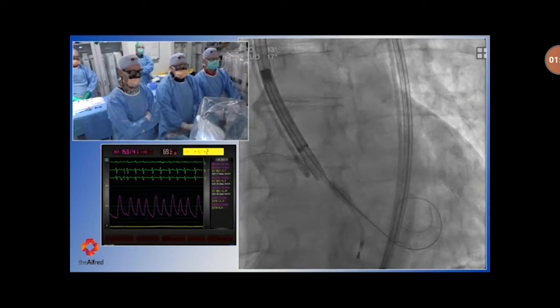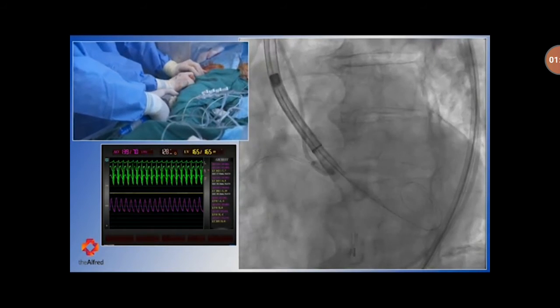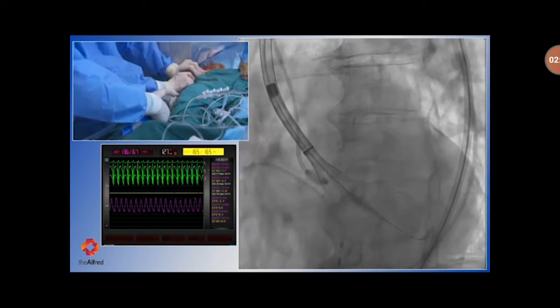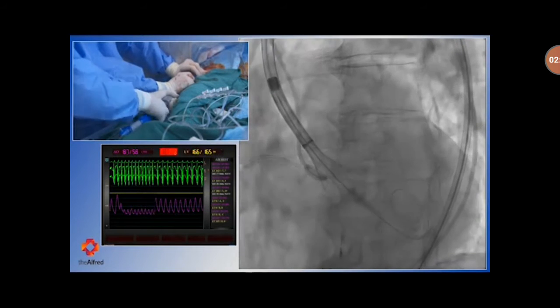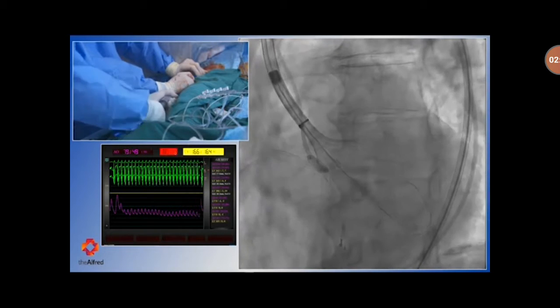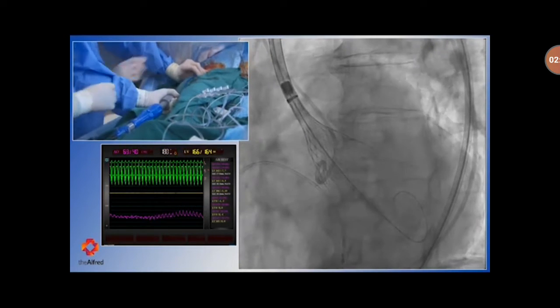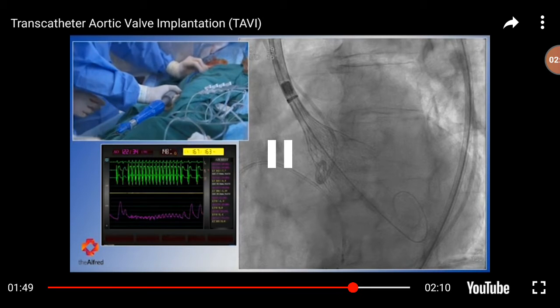Stephen, we'll start to just slowly flare this valve. So it's a good spot to be. So start to flare a little. So let's pace at 180, please. Stephen, go ahead. Keep going, keep going, keep going. Pacing off. Fluoro save. So the BP's come back nice.